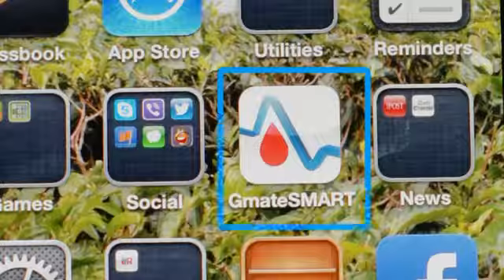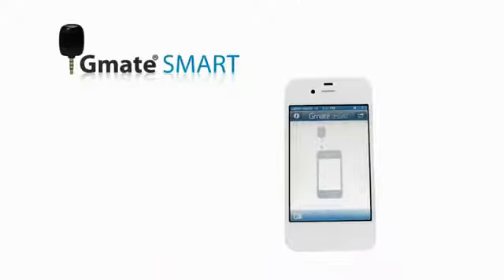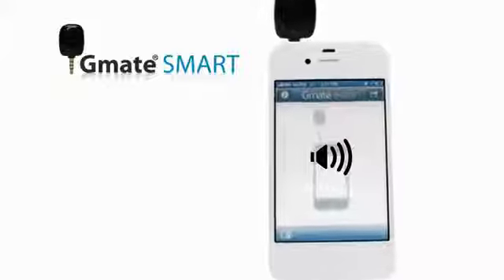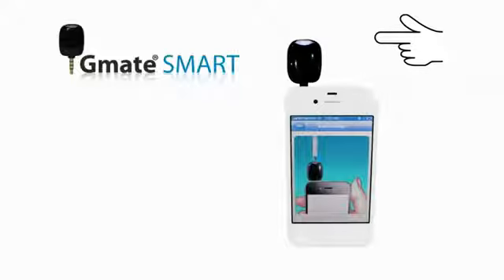Tap the G-Mate Smart icon on the smartphone to open the application. Plug the G-Mate Smart meter into your headphone jack. You may see a volume control dialog box appear on the screen. Make sure the headphone volume is turned all the way up so that the G-Mate Smart meter has enough power. The white light will turn on during the meter and Insert Strip will appear on the display.